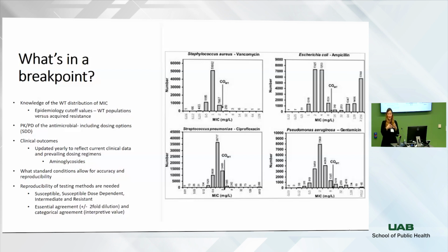And so if this is an area where a drug concentrates, you might still be able to use that antimicrobial. If this is not an area where that drug concentrates, it means you might not want to use that antimicrobial. Typically on the clinical spectrum, we look at intermediate as still being resistant. So a lot of times you'll see this referred to in the literature as susceptible, and then you'll see this other broad category out here that basically says non-susceptible, and intermediate falls in the non-susceptible category.